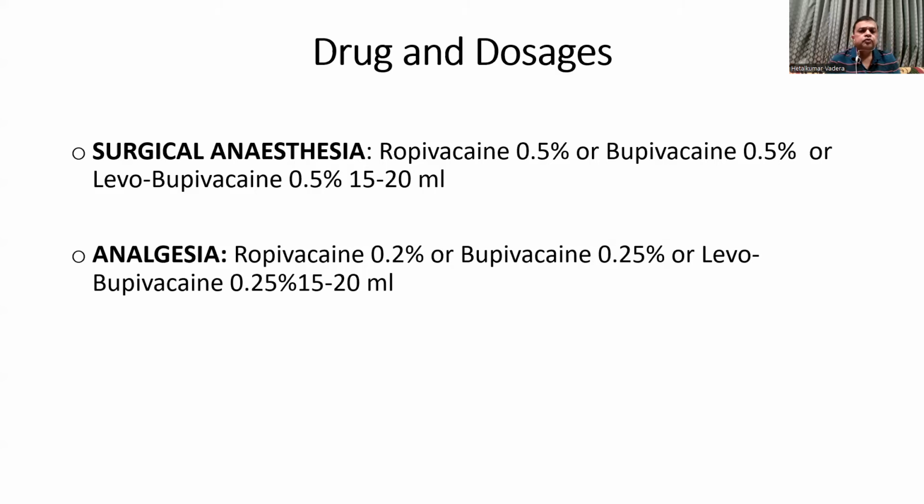So this is how you can do the interscalene block with PNS. It is a very superficial block. You get the response roughly at 1 to 2 milliamps. If you are not getting it, don't go too deep. Relocate the needle, remark the landmark, and try to elicit the proper response. If you are too medial, there are chances you puncture the carotid or IJV, and there will be aspiration of blood. So in that case, you have to go posteriorly.